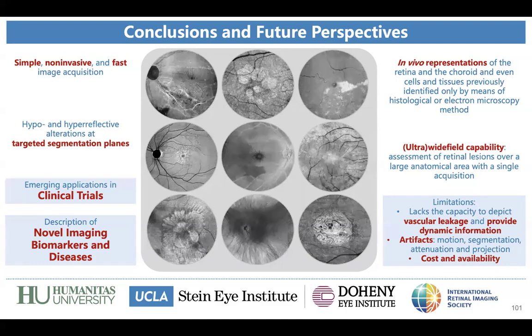Also, we have discussed the artifacts and the limitations of each method and the need for a comprehensive interpretation of the images. In the paper, you mentioned that we presented the blue light reflectance imaging. We found very useful information from a no-cost method.